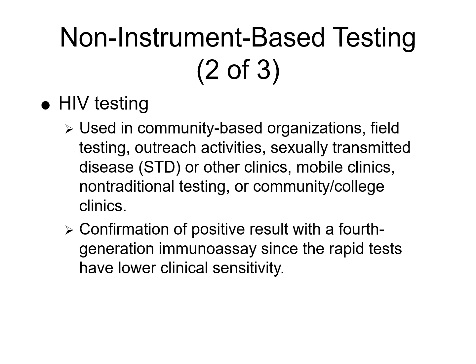Some best practices: we want to make sure we train the personnel to perform and interpret rapid tests accurately and ensure proper documentation and linkage to care for positive results. So making sure that they get that confirmation testing if they do have a positive result.